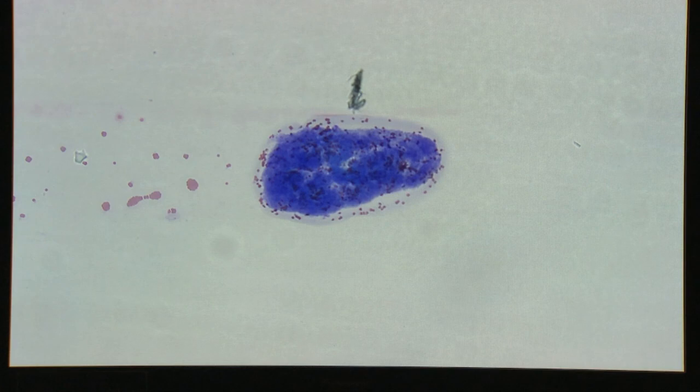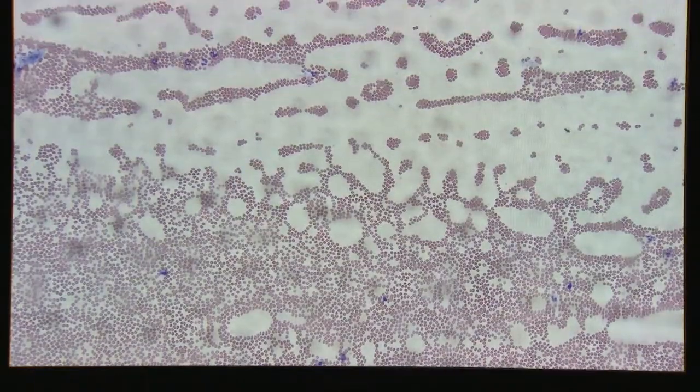That way you will be sure that you will find any platelet clumps, which is represented here, any parasites such as heartworm. They hang out in the tails and often on the sides of the smear. Sometimes you will see mast cells out here, and sometimes other atypical cells, but they can be harder to spot. But the main things are platelet clumps and parasites.